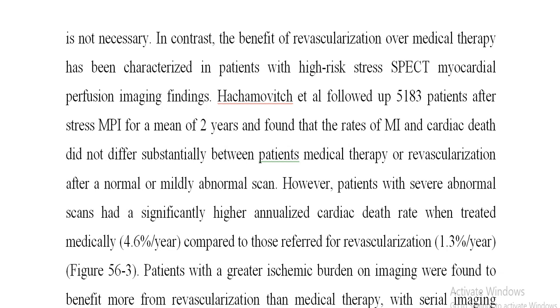Survival was significantly improved in those with severely abnormal scans who underwent revascularization. P<.01 versus patients undergoing revascularization early after nuclear testing. P<.001 within patients treated with medical therapy after nuclear testing. NL, normal. ABNL, abnormal. These principles are shown to impact favorably in terms of both patient outcomes and cost when applied clinically. Several large studies have focused on the clinical utilization of stress MPI to guide patient management and have shown that referral for coronary angiography is accordingly low.